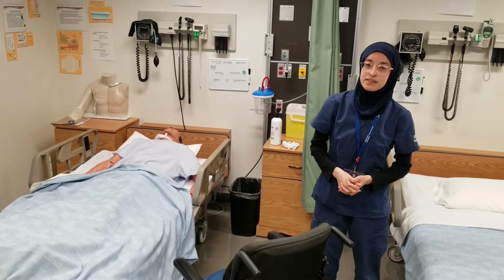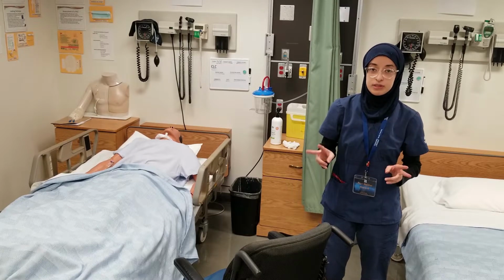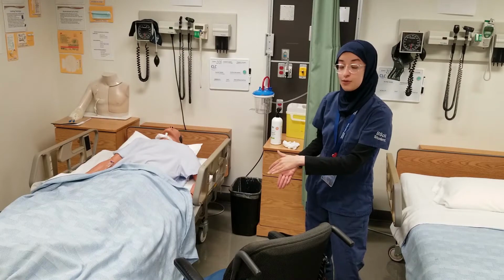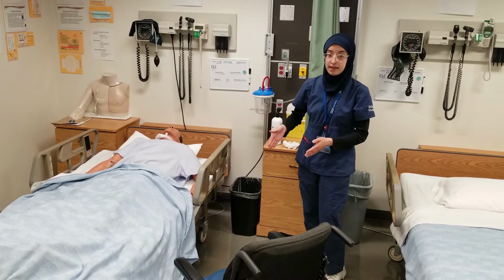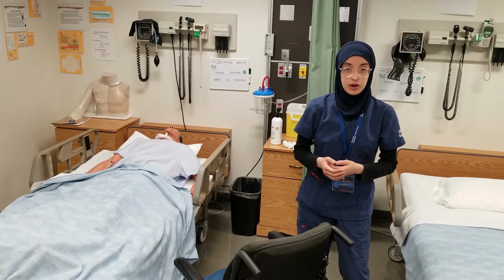I'm a fourth year peer mentor in the general lab, and today we're going to go over the transfers OSCE. So today we're going to talk about two different techniques. One, where we're placing the wheelchair at the foot of the bed, facing the head of the bed at a 45-degree angle, and the second will be placing the wheelchair at the head of the bed at a 45-degree angle facing the foot of the bed. Both techniques are correct, just go by whatever your lab instructor taught in your lab for your OSCE.